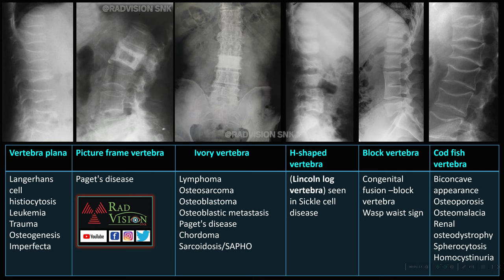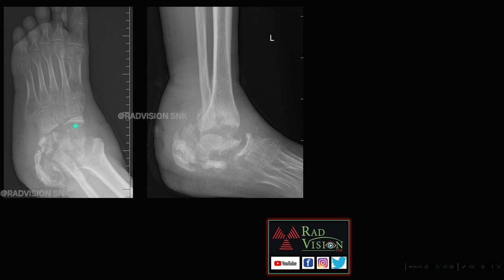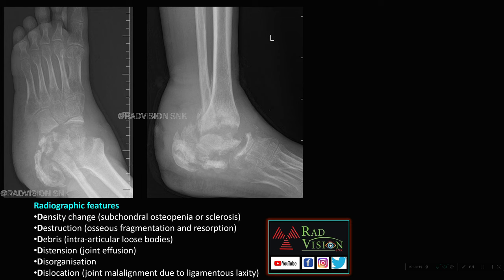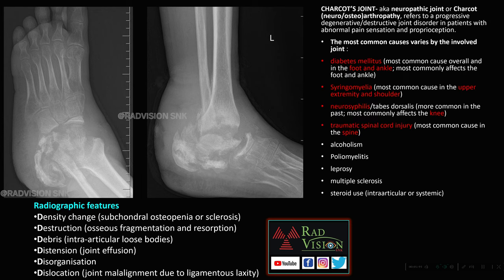This one slide sums up all vertebral patterns. Next, an adult presented with swelling around the ankle, showing increased bone density, destruction, debris, disorganization, distension, and dislocation of the joint, along with arterial calcification — an indirect clue suggesting diabetes. This is a classical case of Charcot joint with the 6 D's. Other common conditions causing Charcot joints include diabetes mellitus, syringomyelia, neurosyphilis, traumatic spinal cord injury, poliomyelitis, leprosy, and steroid use.